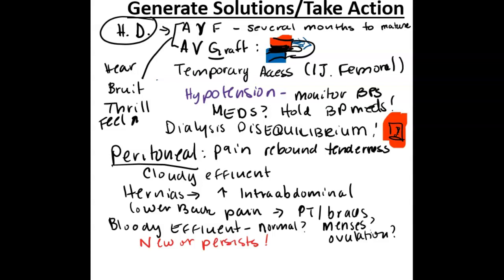As far as generating solutions and taking actions with the continuous renal replacement therapy, outside of mentioning that, again, it's an ICU level of care, doesn't need to be done in dialysis, and is for our physiologically unstable patients because it doesn't lead them to have too many drops in their blood pressure. The nurse that's doing it is continuously monitoring their fluid and electrolyte status and making sure that things are adjusted so that the person does well.